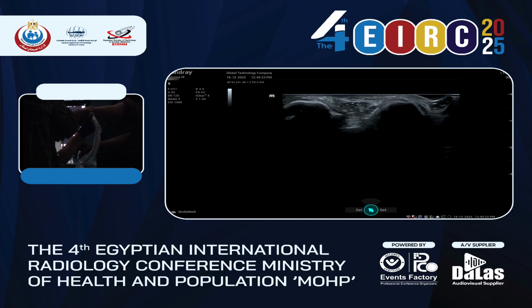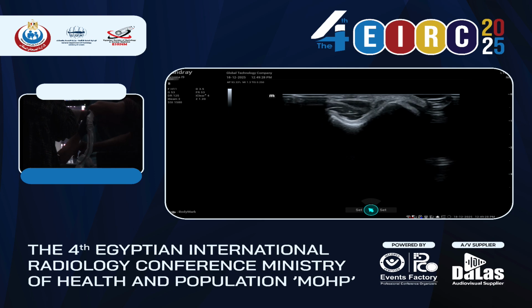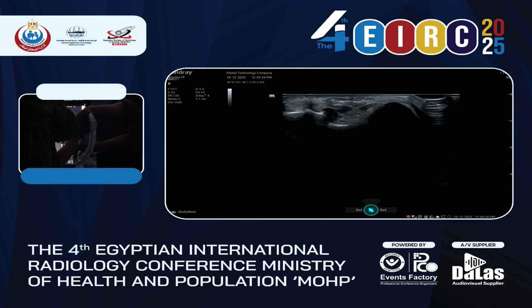And in this specific person, you see that there is no instability because the nerve stays in the groove, it doesn't go outside. But you can have instability as part of normal conditions, as part of normal appearance.